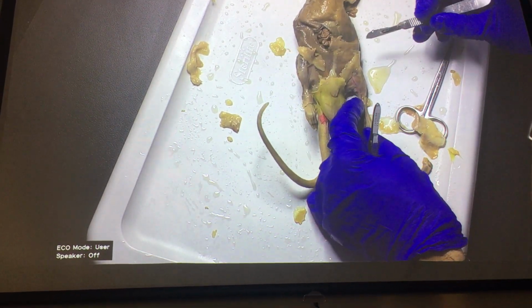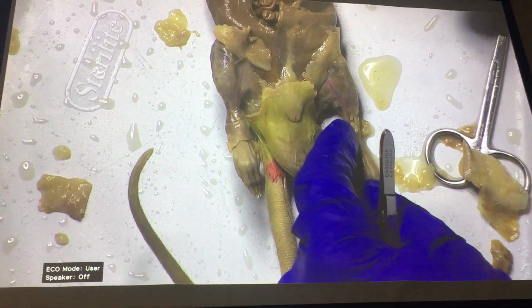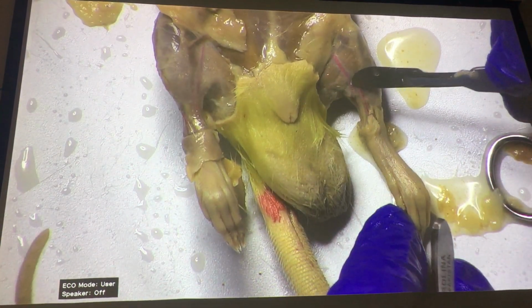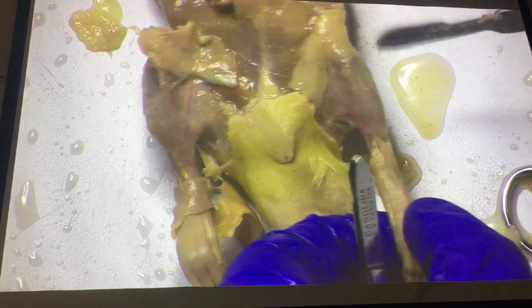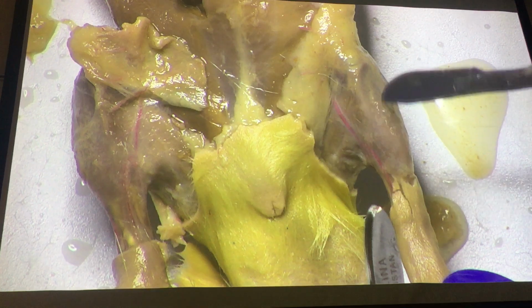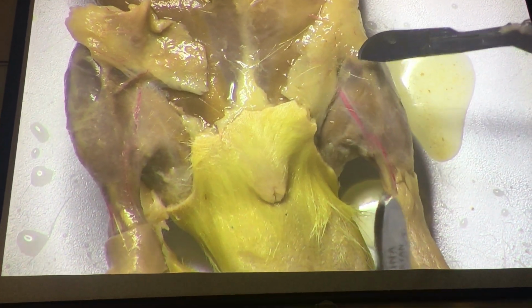When you get to this point, it's a lot easier than the lateral aspect of the thigh was, okay? But blood vessels here, you want to be careful about. You're not going to go below the thigh muscles, and of course, here's your border. So you don't want to come onto that tendon. I can barely see it through the fascia, but there's the edge of the muscle.